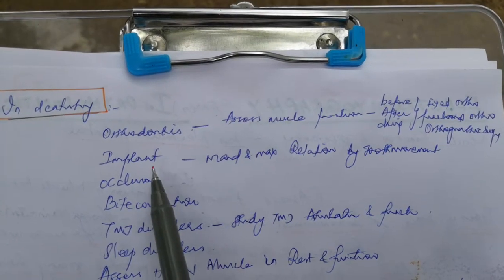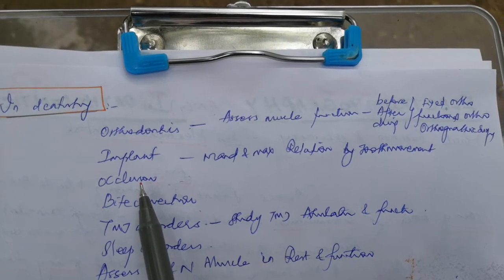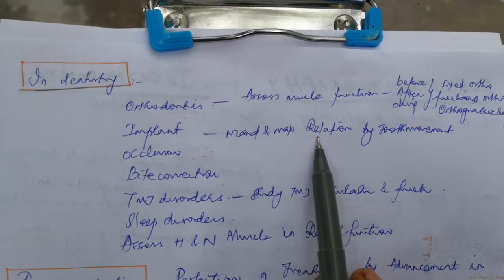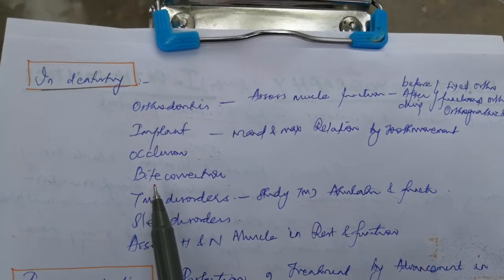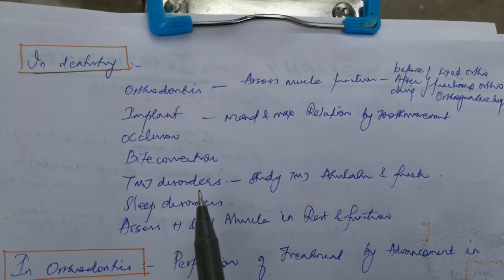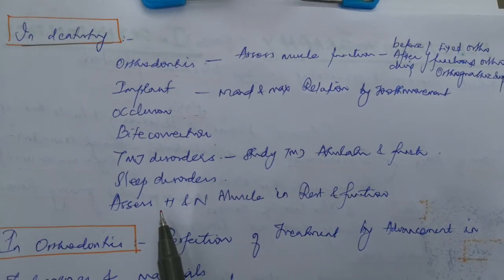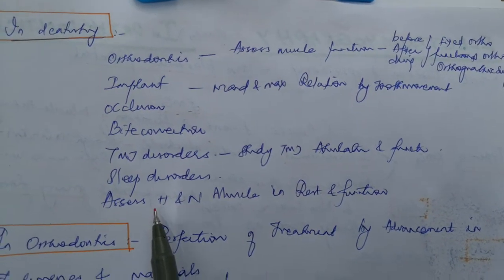Okay, and in implants and occlusion, maxillomandibular relationship by tooth movement, it is useful. And in bite correction, TMJ disorders, to study articulation and function, and sleep disorders, to assess the head and neck muscles in function and rest.